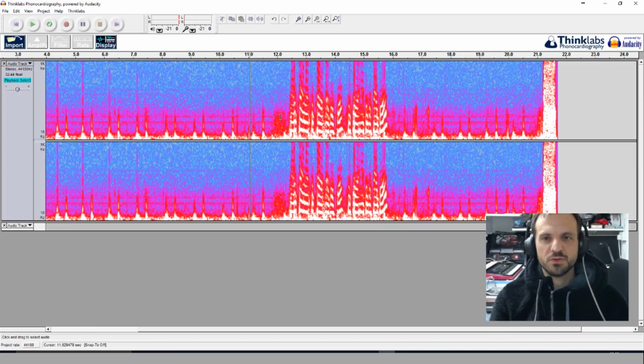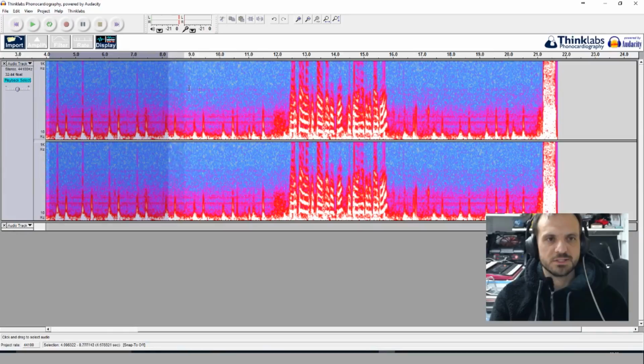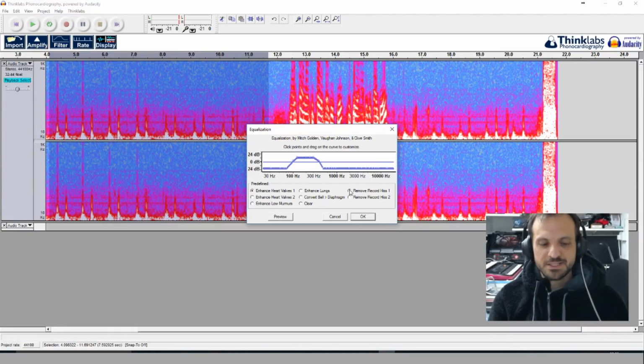And what you can do here is enhance these various sounds. So I'm just going to give an example. At the beginning, you can select the region you want, and if the microphones are not particularly great quality, you might want to remove the hiss, or you might want to try to enhance it. You can just see it's standard graphics equalizer settings here. It's just trying to enhance bits and quiet down other frequencies. So let's try enhance heart valves.